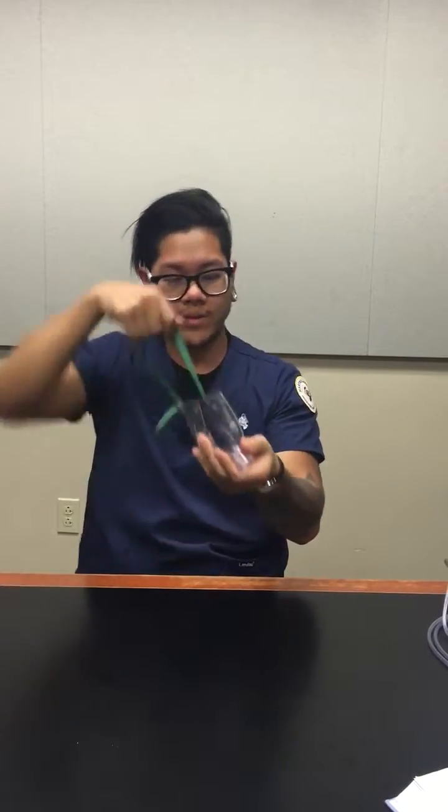And then I'm gonna show you how to put it on, and then I'm gonna go to your oxygen blender. So this is the, hold on 1 second. Okay, so the face tent goes like this, and then you could tighten and loosen it too, and then oxygen comes in through.